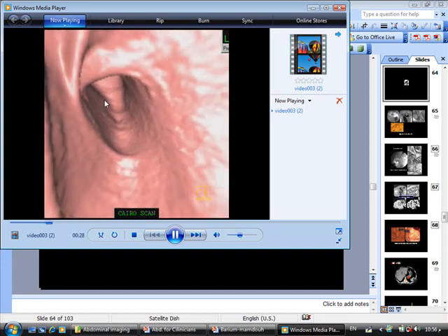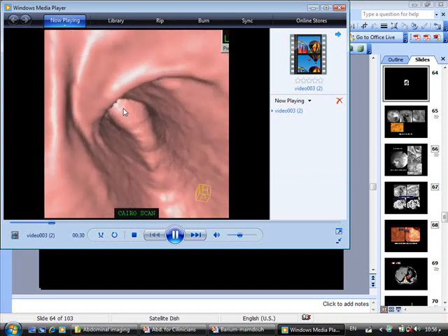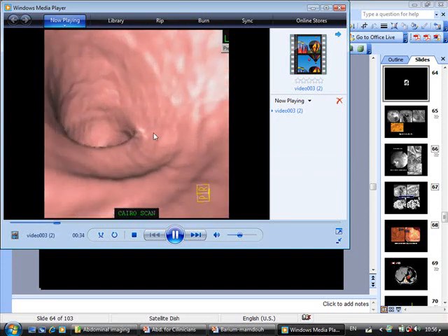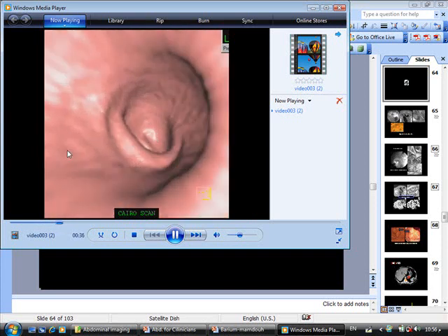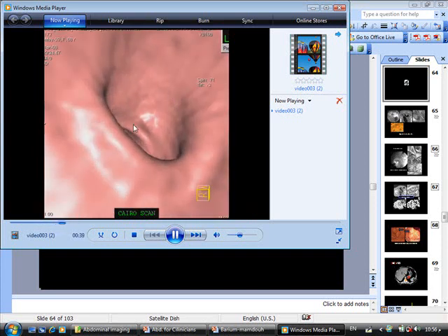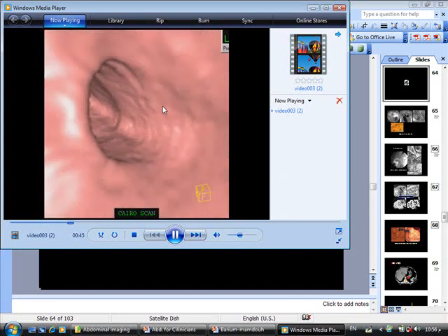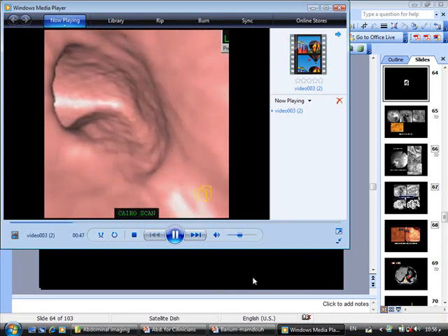You see here. Then you pass until you may see a polyp, a stricture, a diverticulum, or an ulcer, and every now and then you have to change the direction of the camera in order to see much more inside the colon until you finish the whole colon, and you may go back in the opposite direction, no problem.